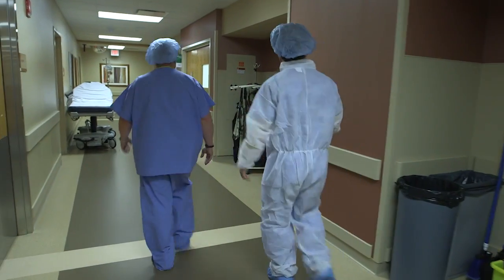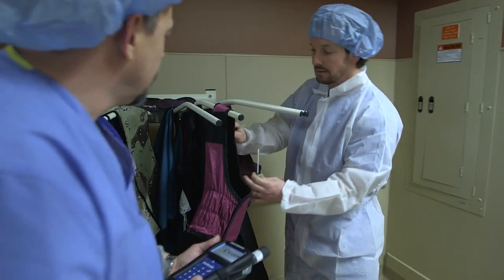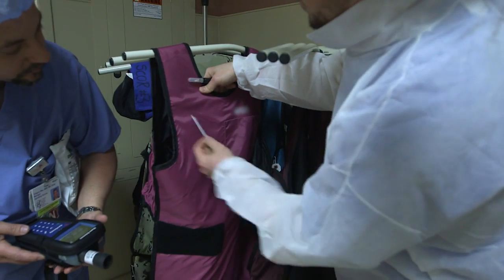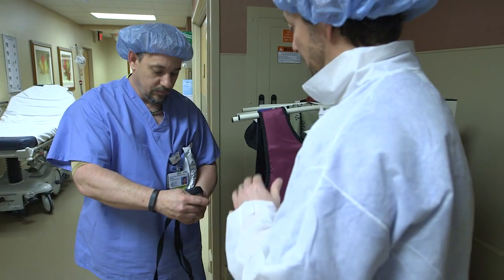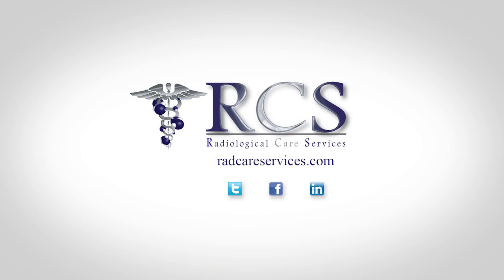The staff members who do particularly orthopedics or spine procedures where they have to wear apron all day long, they are very choosy about which piece of lead they're going to put on, because that one smells, or I think that one's dirty, or that thyroid collar is disgusting. And we should never be in a position where our staff have to use those phrases about what's really personal protective equipment that we're providing them. They should feel good and confident about what they have to put on. And I can tell you now that they do.